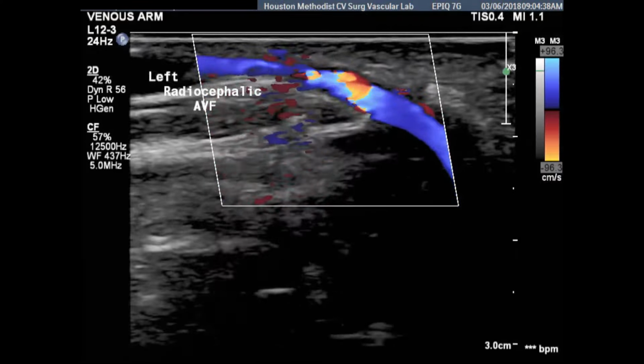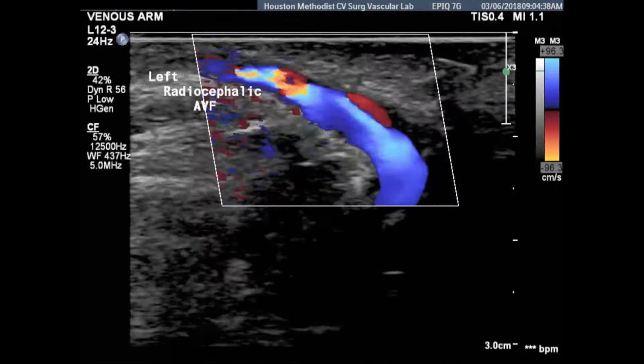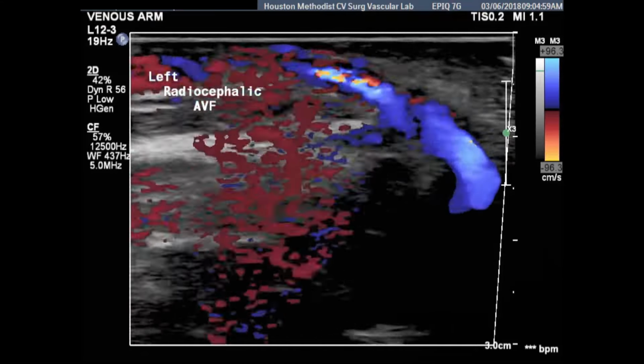And you can sort of make that out looking at your flow disturbances on your color flow image. Too bad my mouse is not showing up, but definitely you can see the two different aliasing on that color flow. I think this is my favorite clip, how you really see that, and when you look at the ultrasound, it's perfectly matching. It is. It's striking. It's a really gorgeous image.